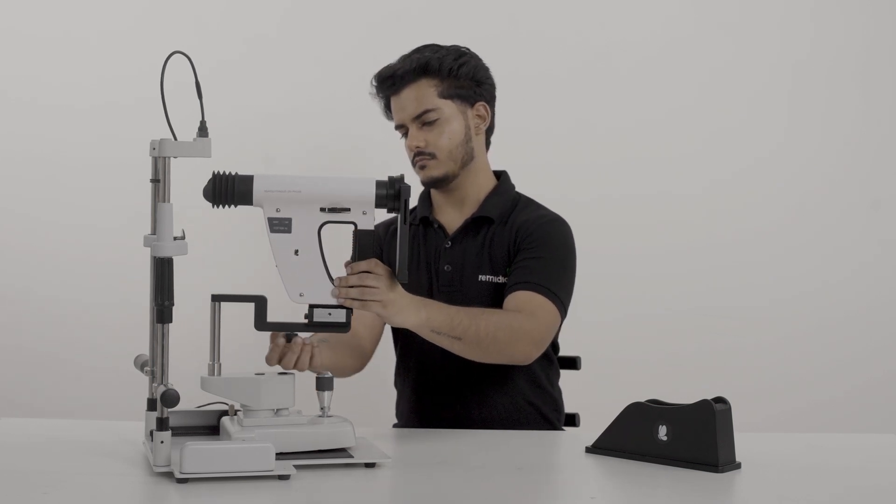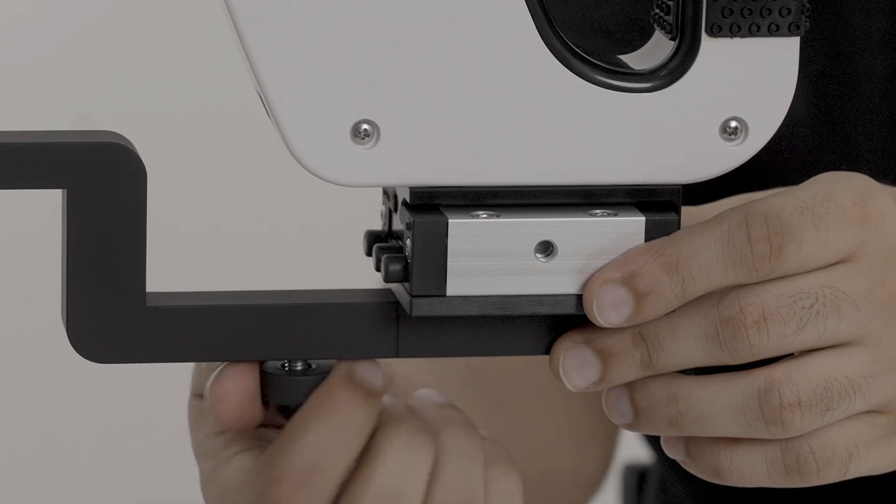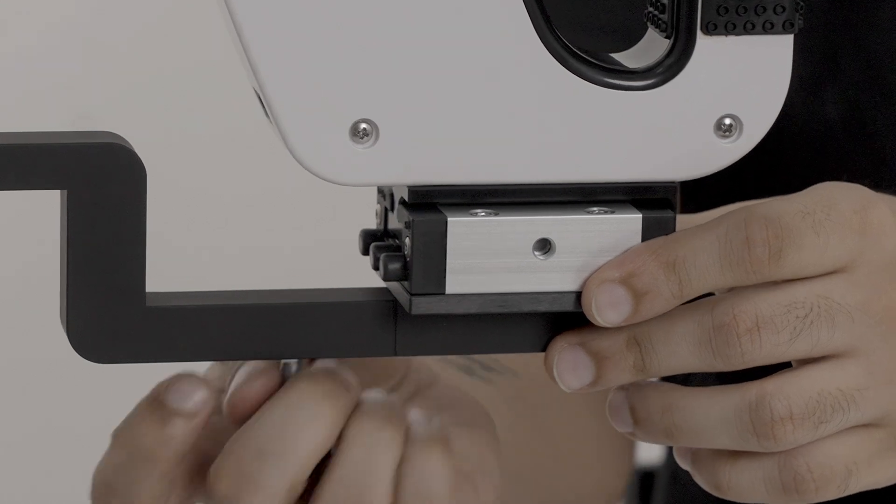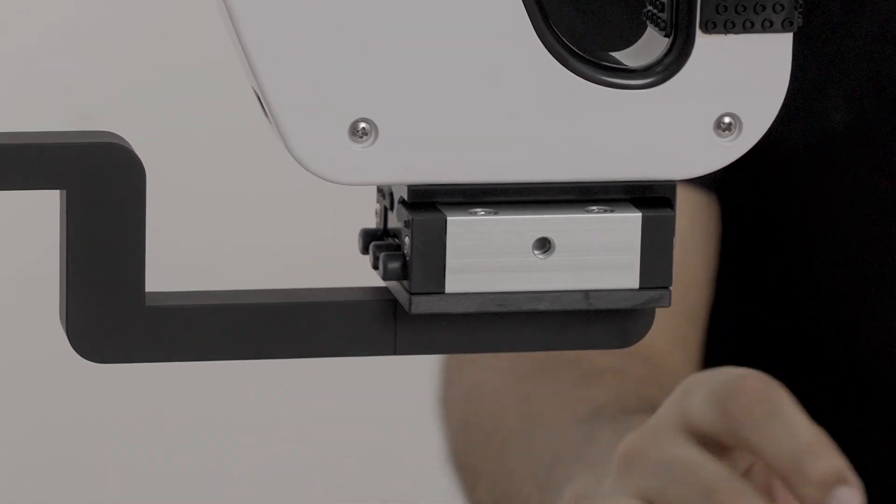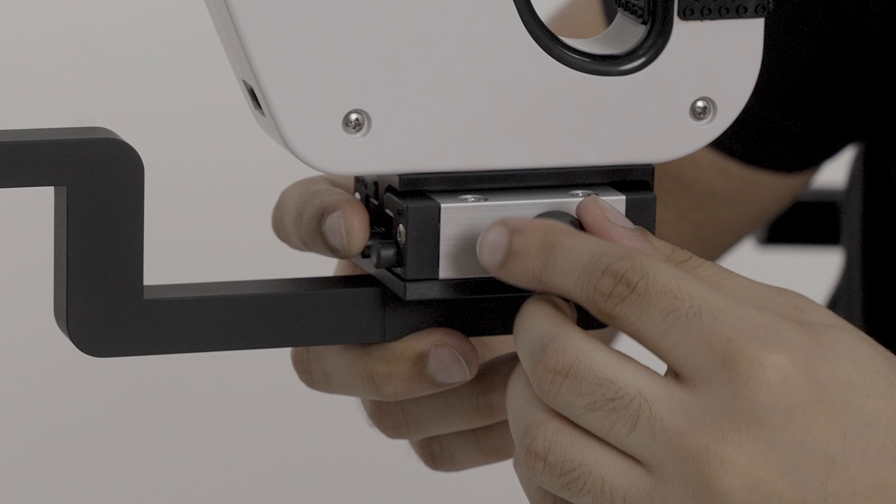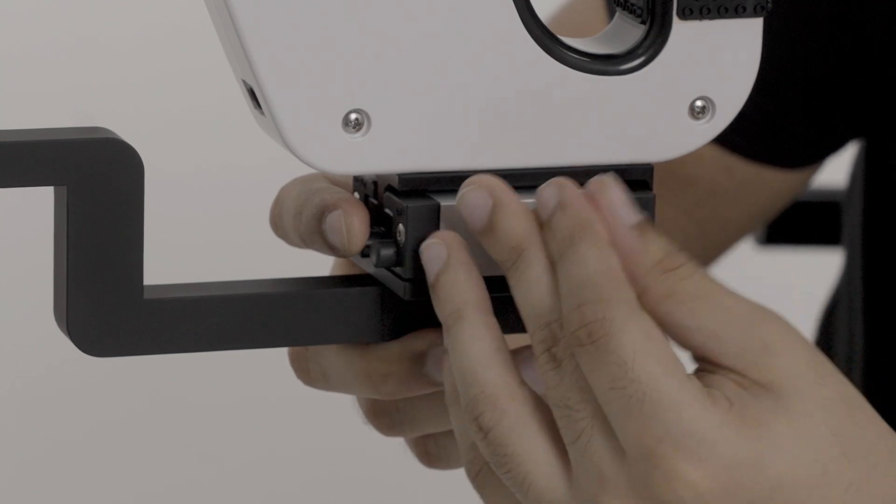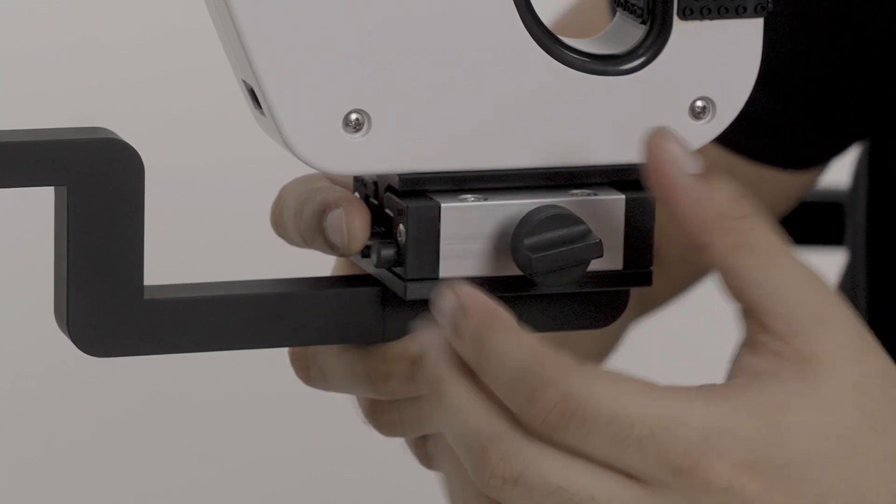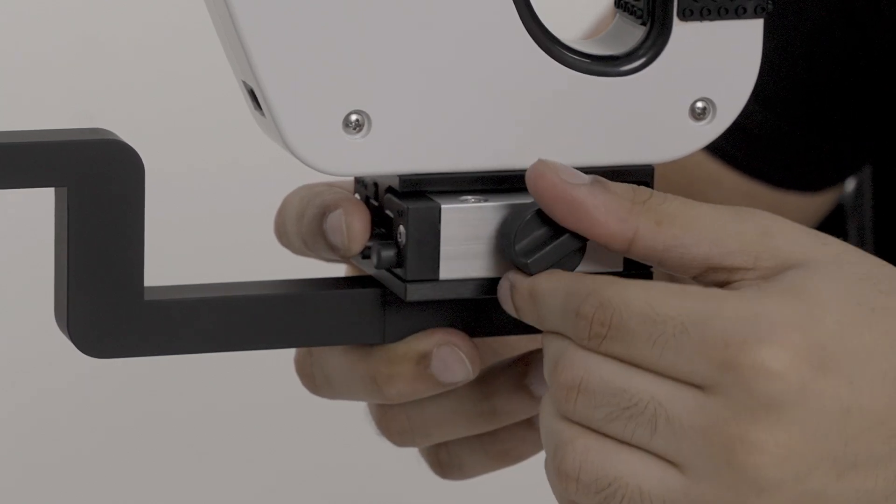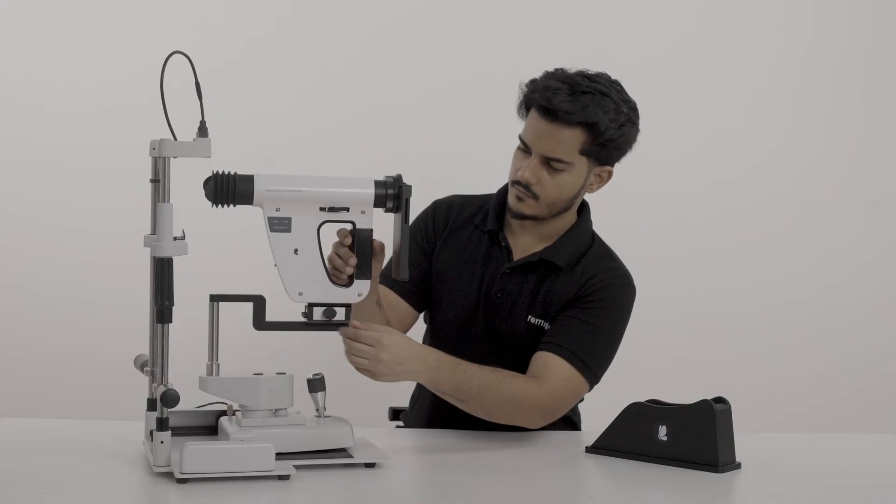Then remove this knob from below the rod and screw it below the FOP to secure it. The FOP is now properly mounted and ready for use.